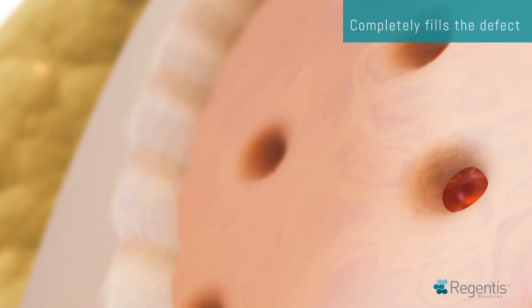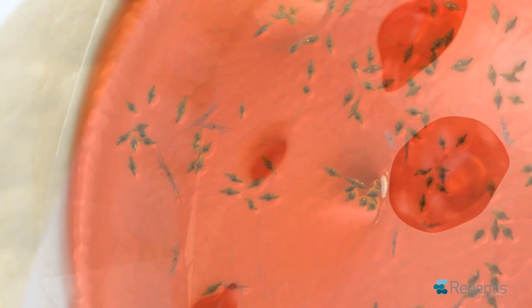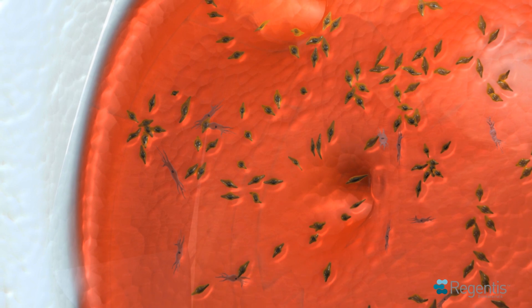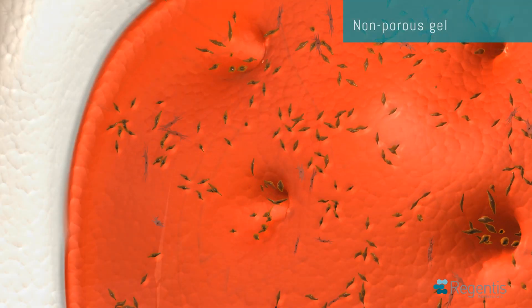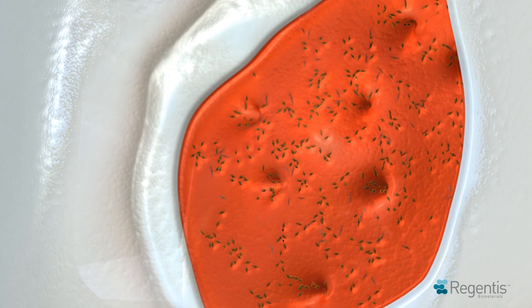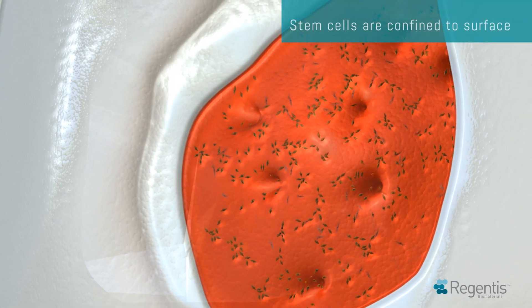Following the bone marrow stimulation, blood from the underlying bone is released and is rich in stem cells that migrate to the implantation site due to the non-porous nature of Gelrin-C. These stem cells cannot penetrate the implant but are confined only to its surface.